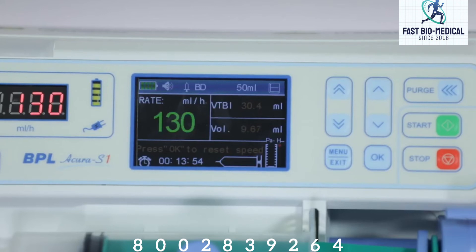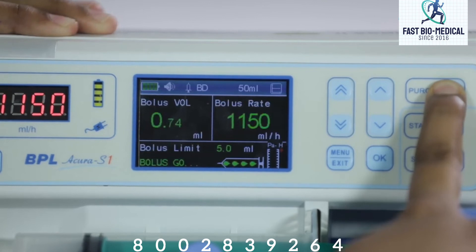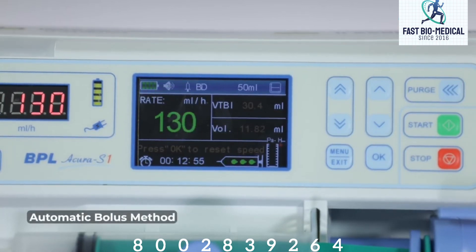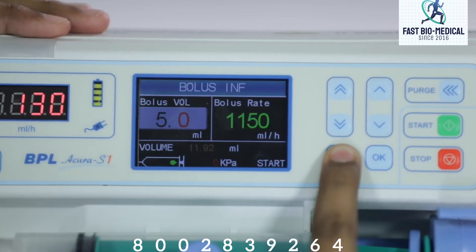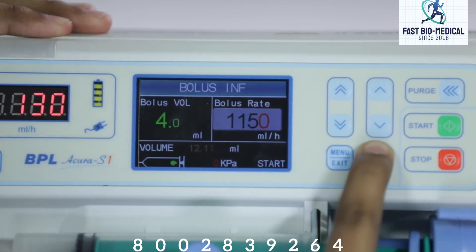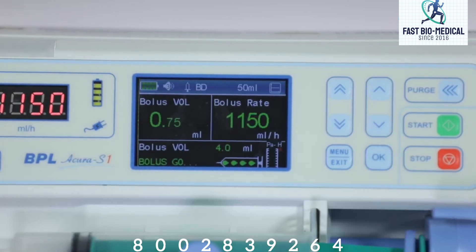Let us see how to give bolus infusion. There are two ways to set it. First, the manual bolus method: press and hold the push button and the pump will inject at the bolus rate corresponding to the syringe size; release the key to resume to the original rate. Second, the automatic method: during injection, press the menu key to enter the bolus volume setting interface, set the desired bolus volume, set the bolus rate, and confirm. Press OK — the cursor positions on start — press OK to begin, and the pump will inject at the bolus rate of the corresponding syringe size.